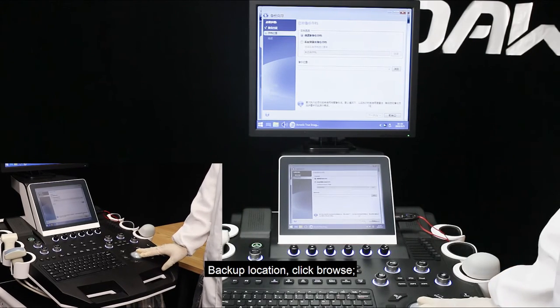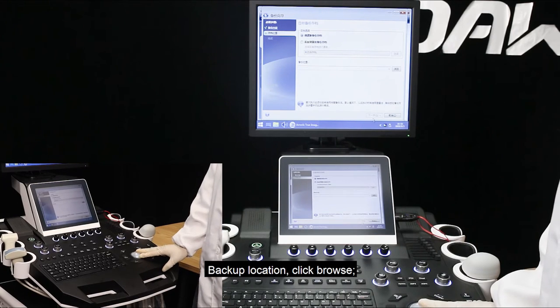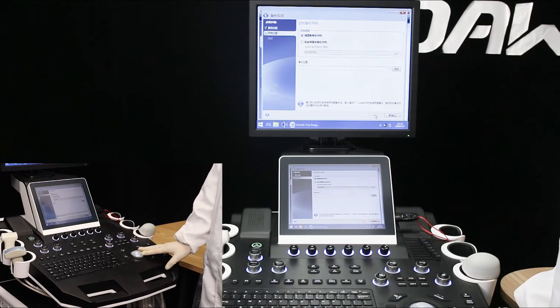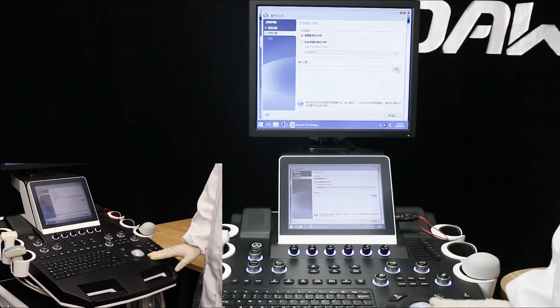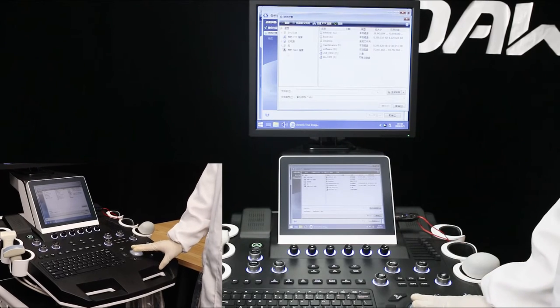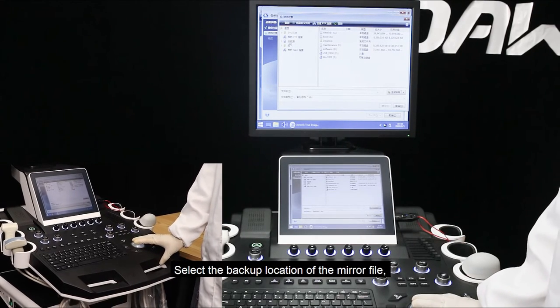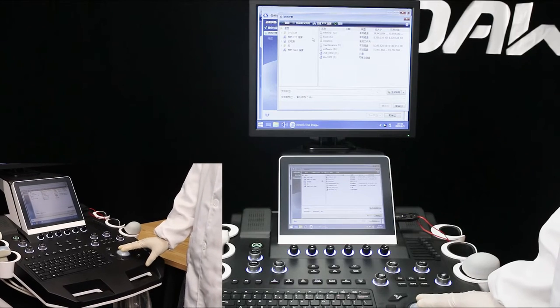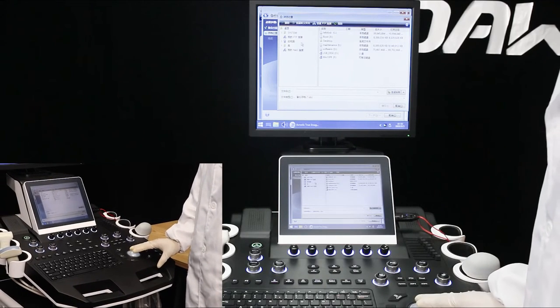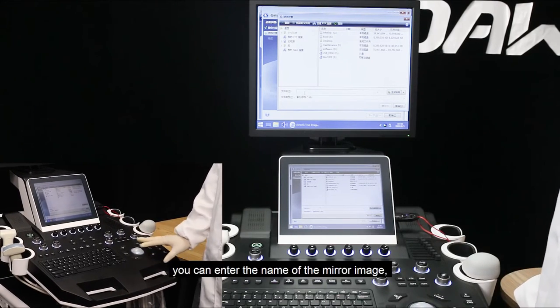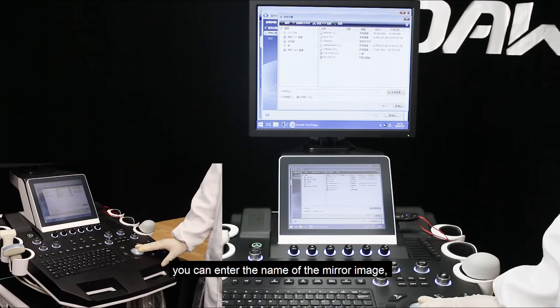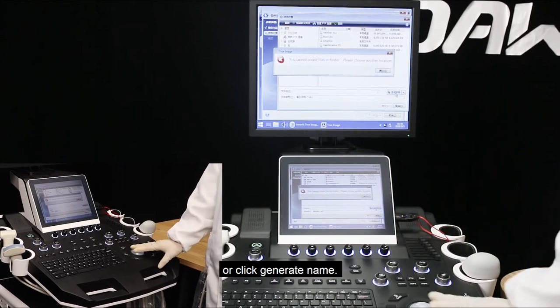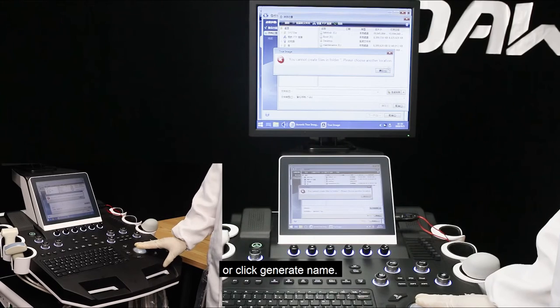Backup location, click browse. Select the backup location of the mirror file. You can enter the name of the mirror image or click Generate Name.